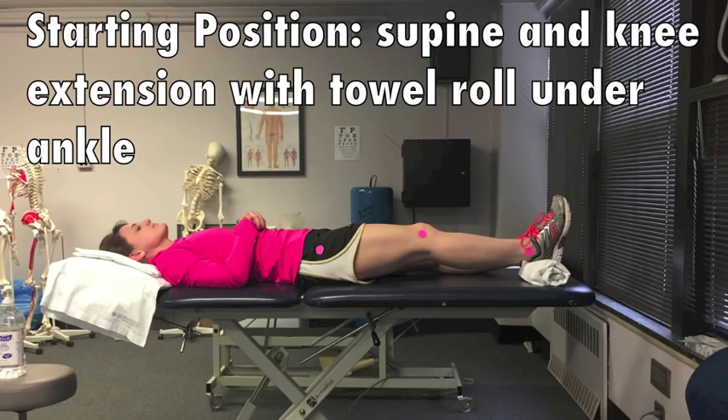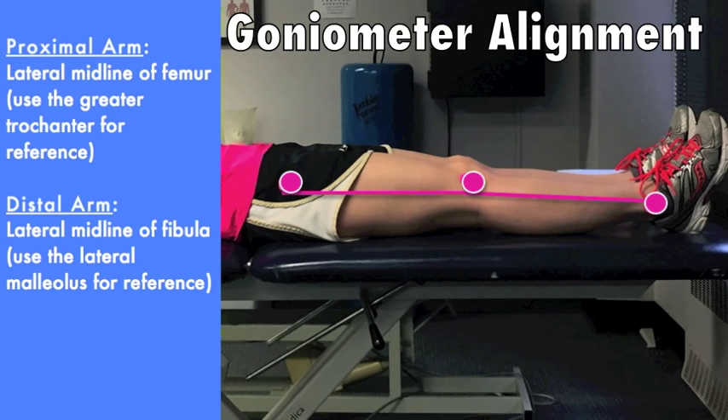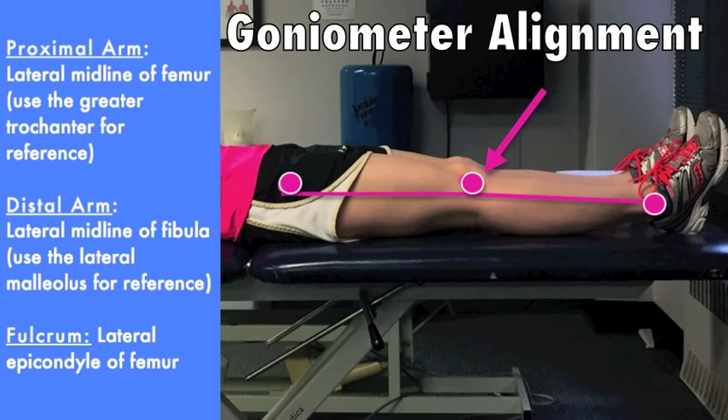Patient is in supine with knee in extension. Be sure to place a towel roll under the ankle to allow the knee to extend as much as possible. Align the proximal arm with the lateral midline of the femur using the greater trochanter for reference. Align the distal arm with the lateral midline of the fibula using the lateral malleolus for reference. The fulcrum should be the lateral epicondyle of the femur.